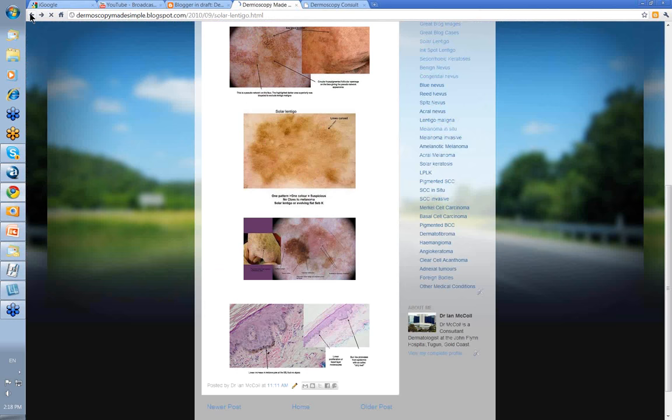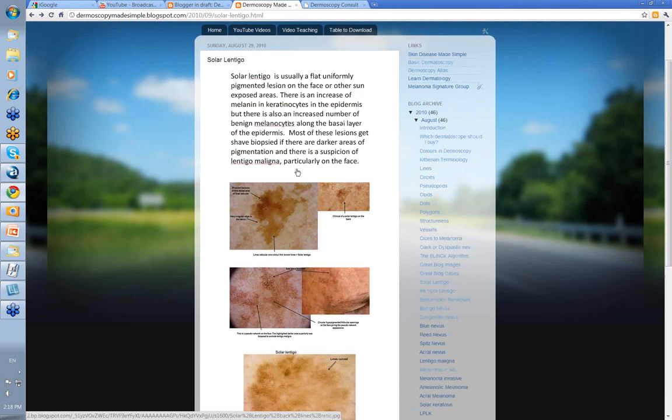So, solar lentigos — we're going to see an awful lot of them on the face. You're basically just trying to exclude a lentigo maligna. It might not be a bad idea after viewing this one to pop down and view the section on lentigo maligna just for comparison. Thank you very much.